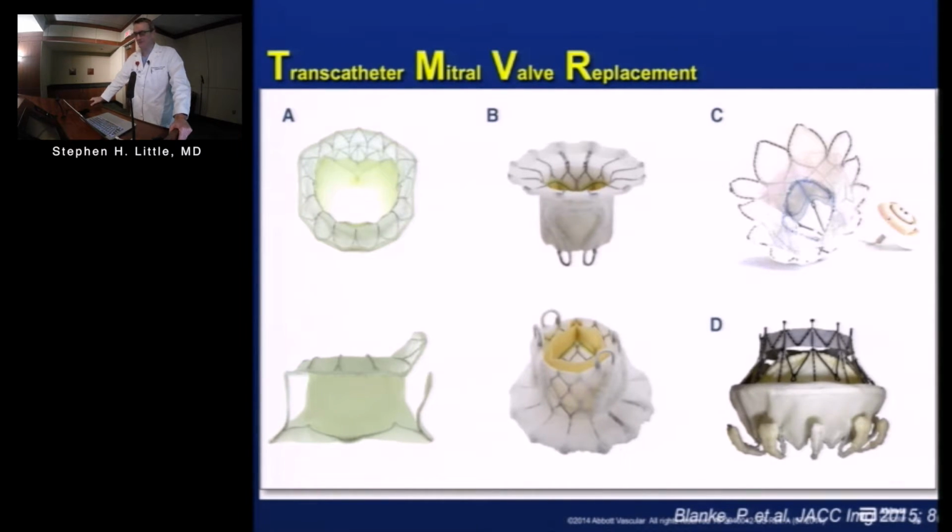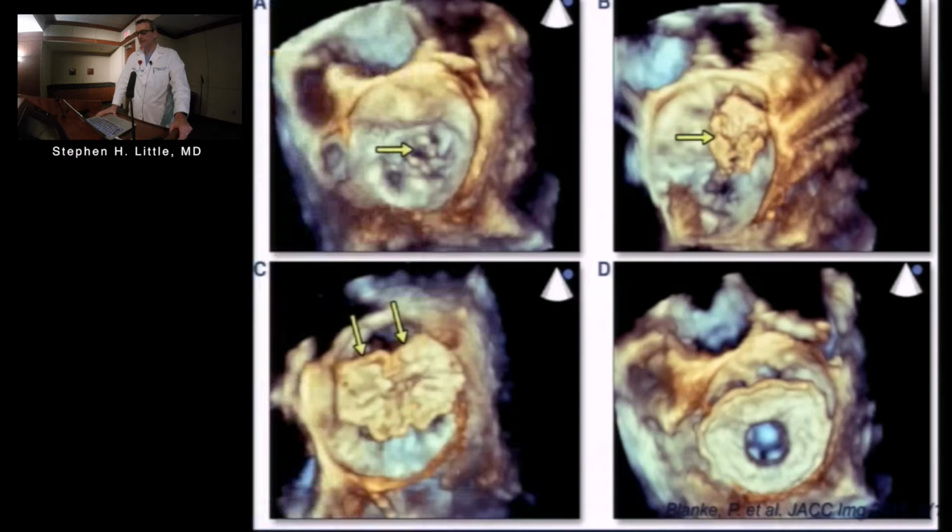And there's a bunch of different devices, and they all have strengths and weaknesses. They're all at various stages of buying and suing each other. And we'll see within the next couple of years which ones come to fruition and which ones we're involved in as a clinical trial site. But again, similar to the valve-in-valve case I showed you, these are going to be echo-dependent implantations largely.